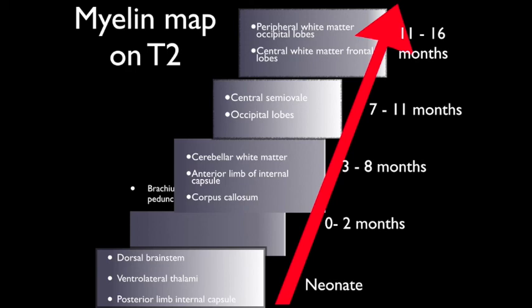As the child gets older, there is progression of myelination to the cerebellar white matter, the anterior limb of the internal capsule, and the corpus callosum, which myelinates posterior to anterior. Further on, the central semi-ovale and the occipital lobes myelinate in the next few months. And over the next few months to the second year of life, the peripheral white matter in the occipital lobes and the central white matter in the frontal lobes also myelinate. This is the progression of myelination on T2-weighted images.